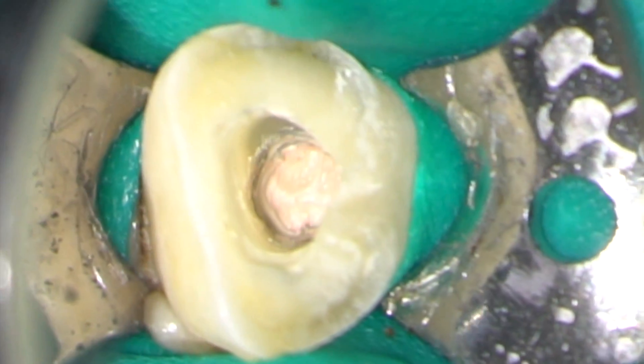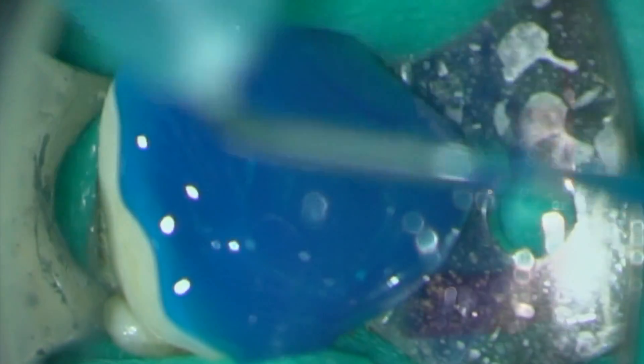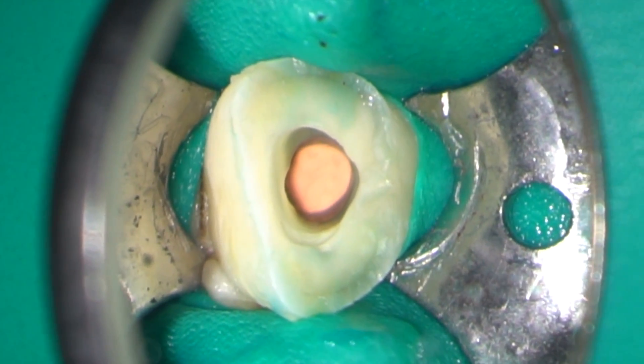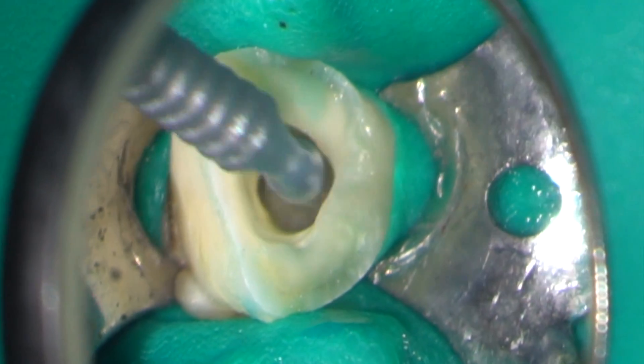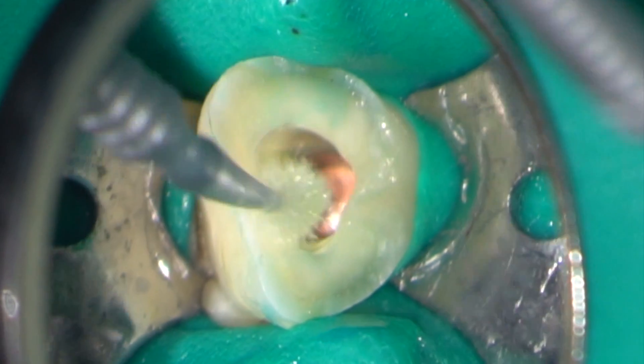The access cavity was etched with phosphoric acid. Dual cure bonding agent was placed on the etched surfaces, and then the access cavity sealed using a dual cure composite.